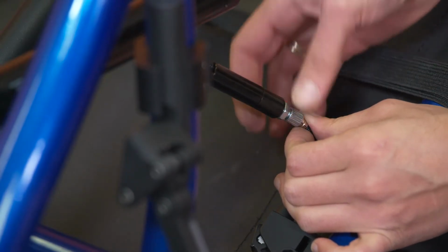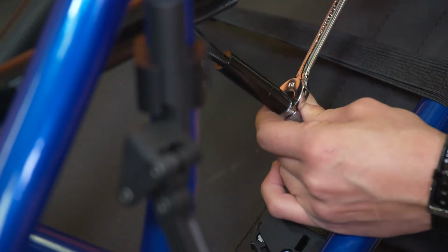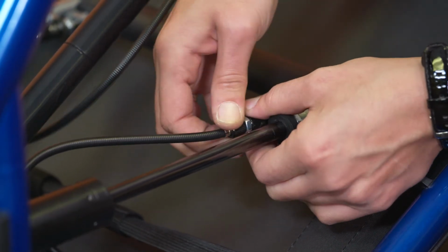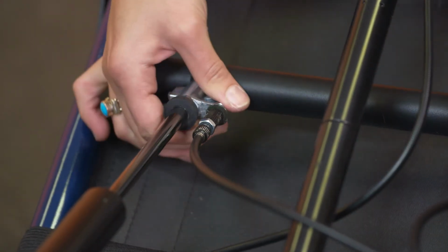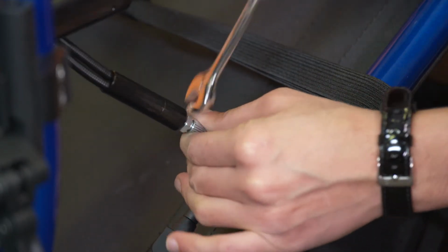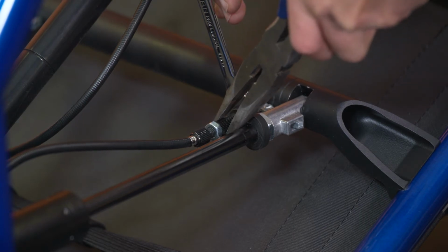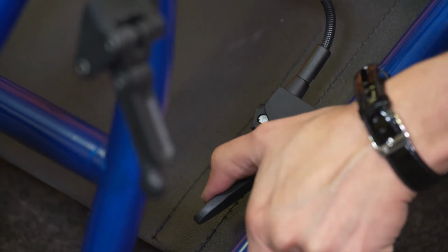Next, you need to readjust the cable as necessary to ensure proper strut activation and release. Start at the main adjustment point located at the cable splitter point, followed by the two end points located at the strut activation end fitting. Tighten the nuts on each adjustment point. And finally, check to make sure the triggers activate the struts properly on both ends.